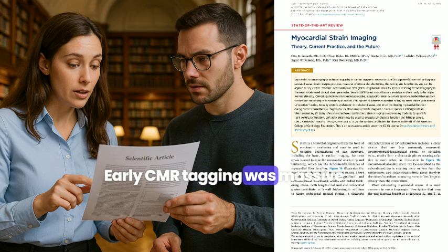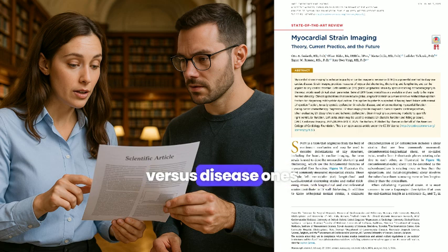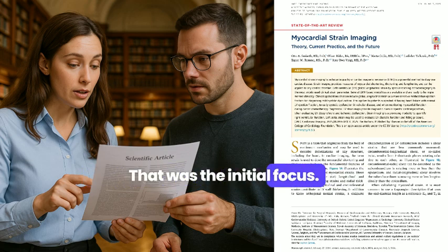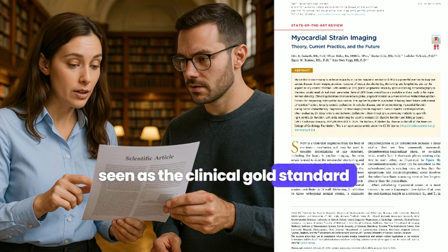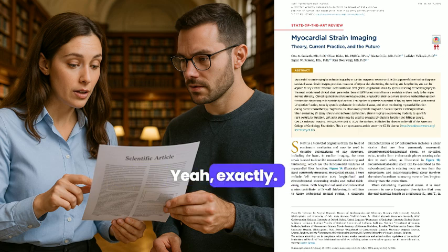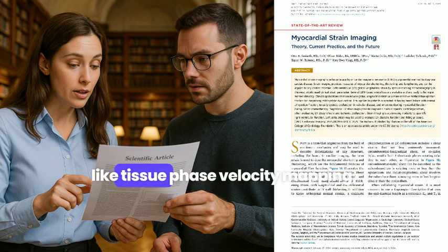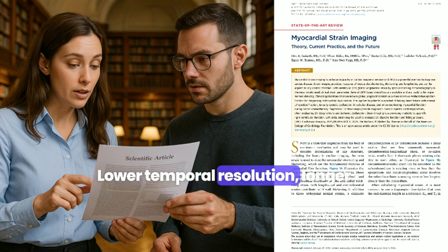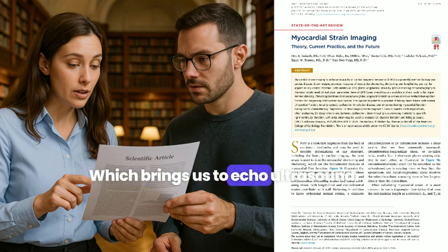Early CMR tagging was massive for understanding segmental strain, in healthy hearts versus diseased ones. Like in heart attacks or hypertrophy. Exactly. That was the initial focus. And actually, CMR tagging is still seen as the clinical gold standard for validating newer methods. Yeah, exactly. Like echo-based strain, which came later. There were other CMR methods, too, like tissue phase velocity mapping, measuring the speed of the muscle. But they had limitations. Lower temporal resolution, longer scan times. Practical issues. Which brings us to echo.